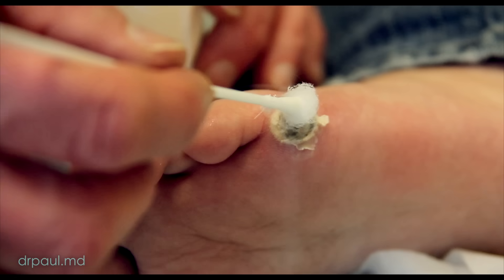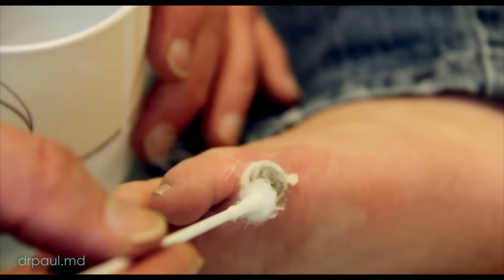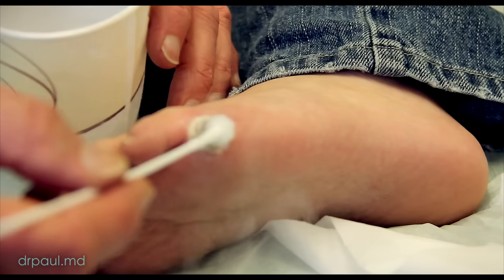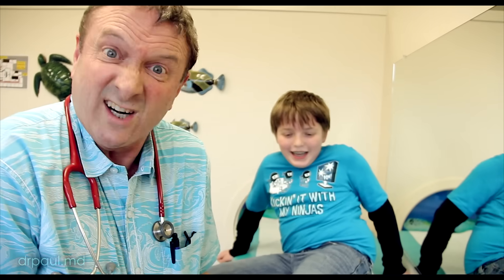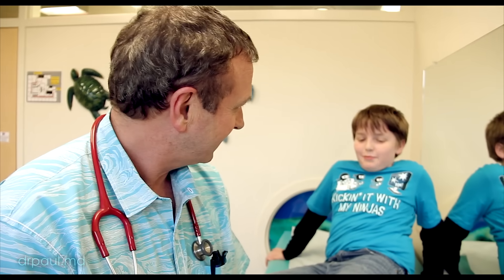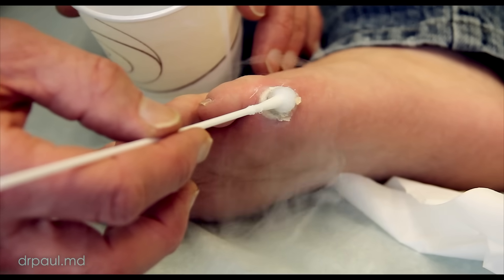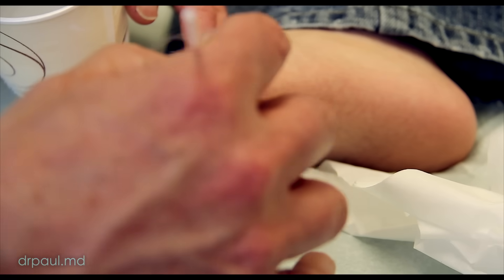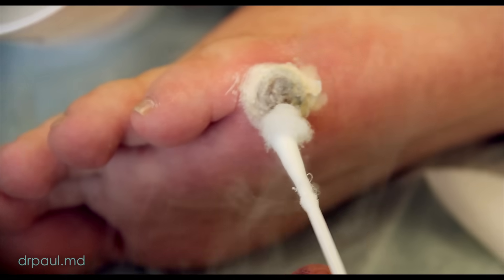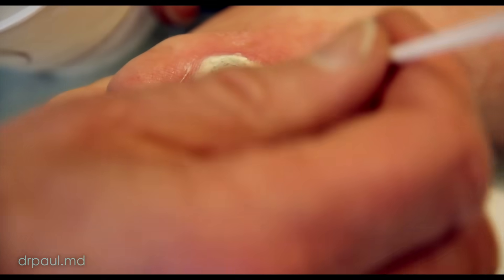I've frozen family members of mine and they were yelping by this time, really screaming loud — but you're still smiling. You know, sometimes I smile when it hurts — helps. That's so cold. It feels like it's numbing. It's just really cold — like you're facing an ice box. I'm going to just go around the edges because this one is just so thick. This part would probably hurt the most because we're going to get a little bit of normal tissue around the edges. Some people will shave off a little bit of the wart first, but since you had tried that, I thought we'd do this first. We're going to have you come back in a month.